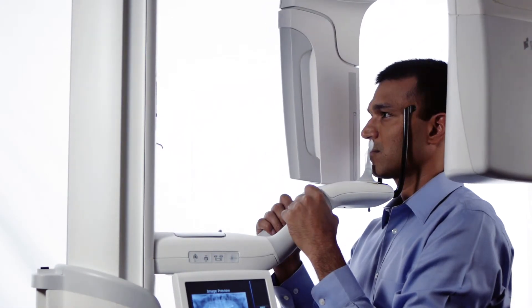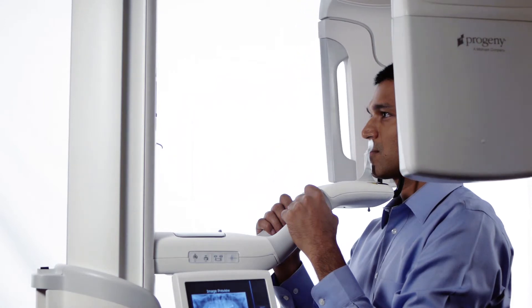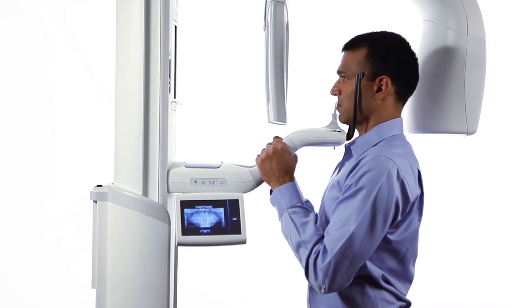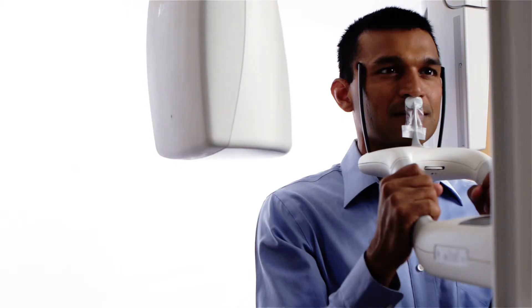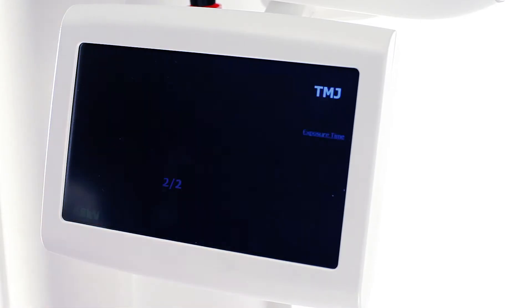As the overhead structure drives to the patient exit position, allow the patient to relax, but advise them not to step out of the structure even when the head positioning wands open. Verify the first TMJ scan on the Vantage Touch display and press OK.